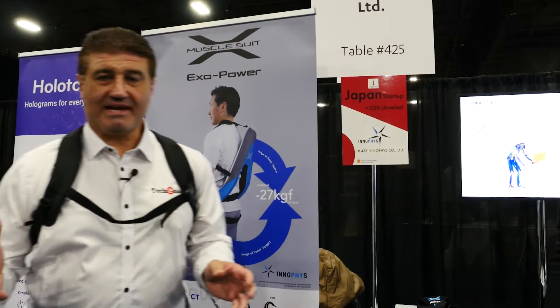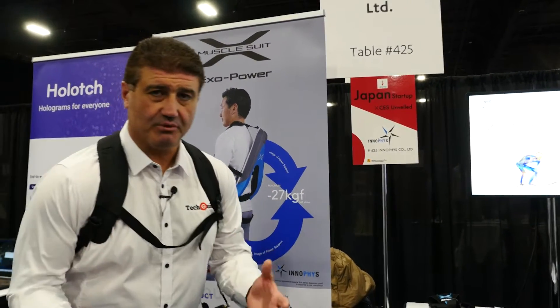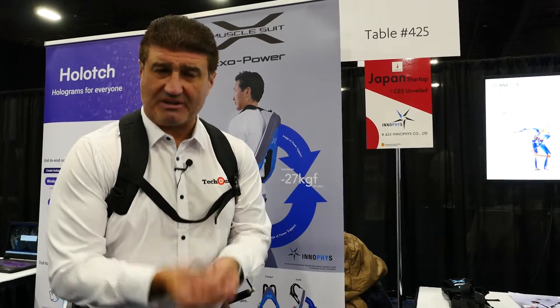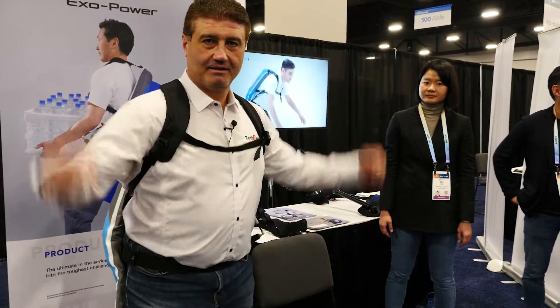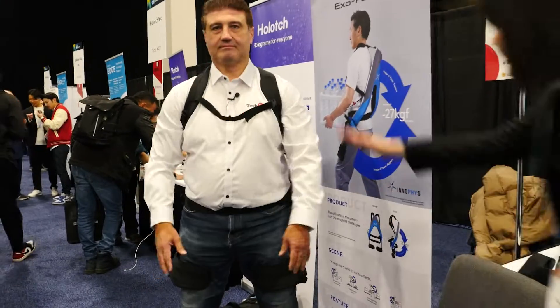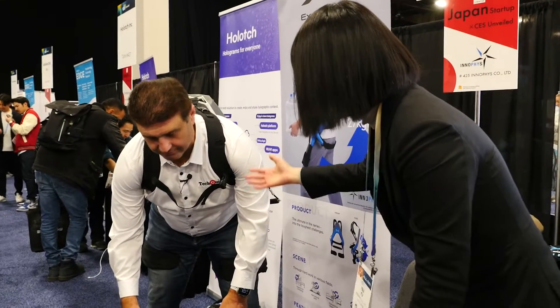What I'm wearing is a muscle suit. This is a product designed to help people with heavy lifting — caregivers, factory workers — because bending over and picking up heavy objects can really hurt your back. It uses air pressure to take the strain and help you lift those heavy objects, or patients if you're a caregiver, without hurting your back.